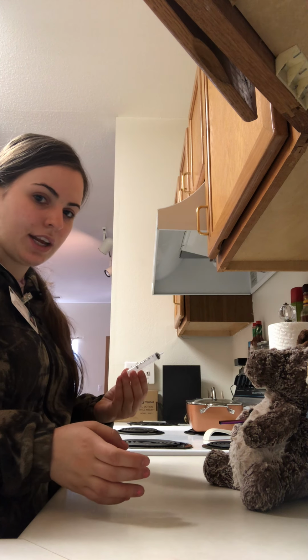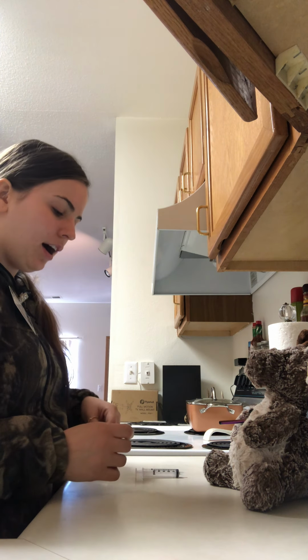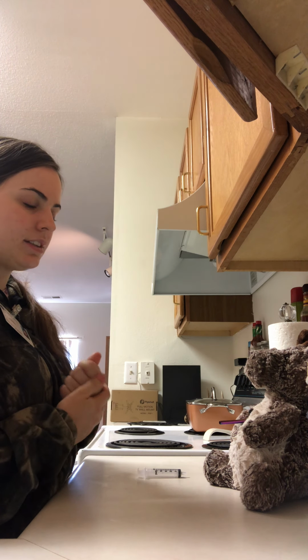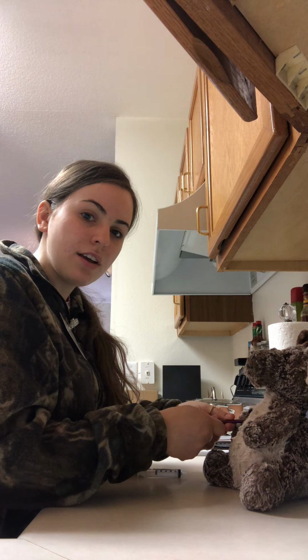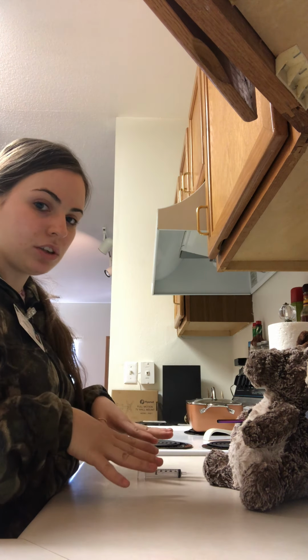I only have 1 syringe today, so I will explain to you what I'm doing as I'm doing it. So I would start out by washing my hands, and then I'd apply gloves, and then I'm going to scrub the hub for 30 seconds. And then after I scrub the hub for 30 seconds, I'm going to wait for it to dry. And then after it dries, I'm going to take 3 to 5 mL of normal saline, and I'm going to flush the line to ensure patency.